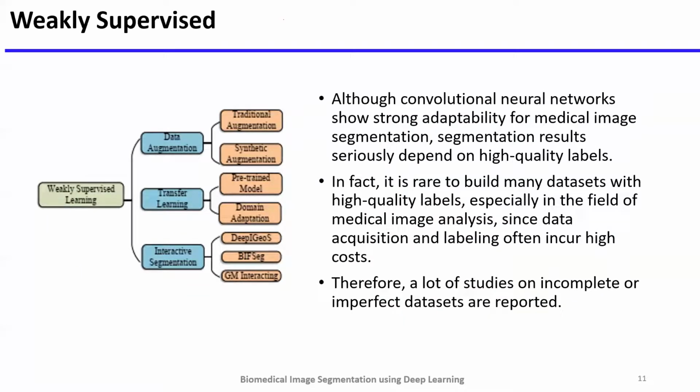Now, what happens especially in the biomedical task, and especially if we are using deep learning models in encoder-decoder architecture, is that we all know deep learning models are data hungry. If you talk about biomedical images, we may be trying to segment a special kind of disease from the image.